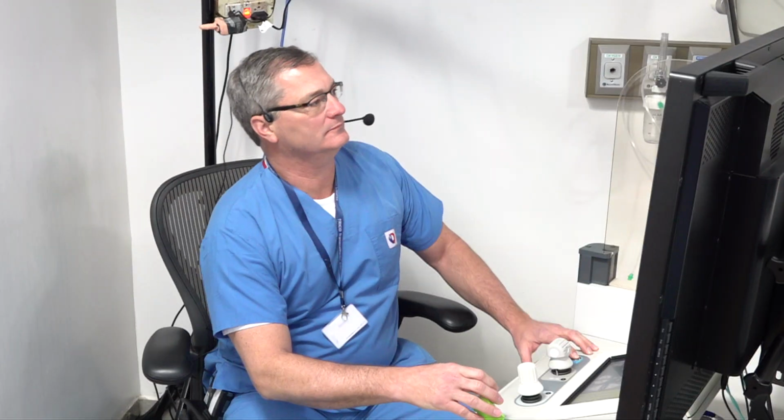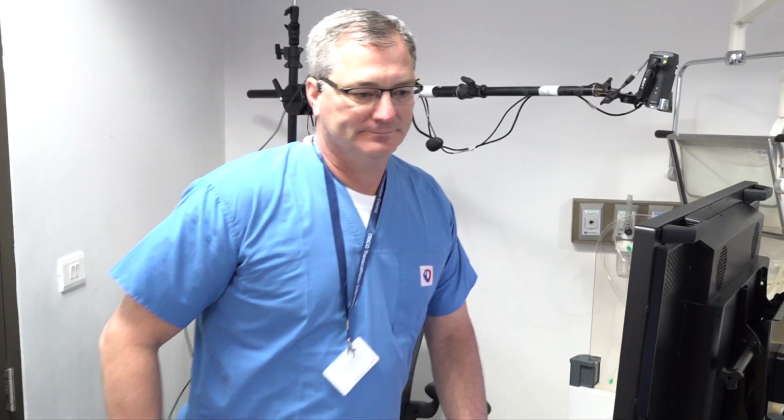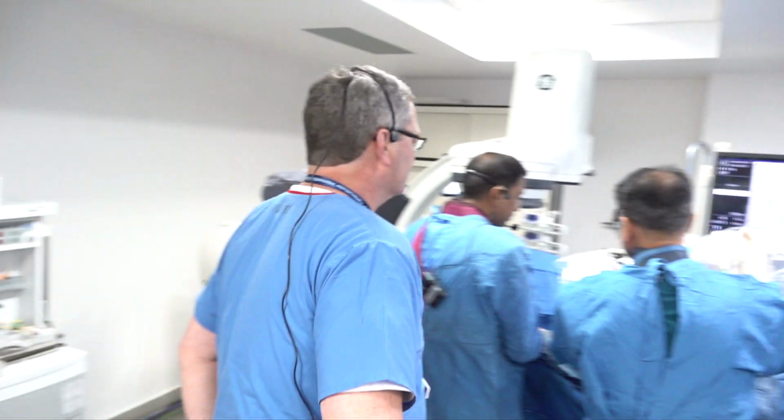Guides out. And next lab, we are now shifting to the south lab where Sanjay is already ready. I am scrubbing with him for a very critical right internal carotid stenosis stenting.